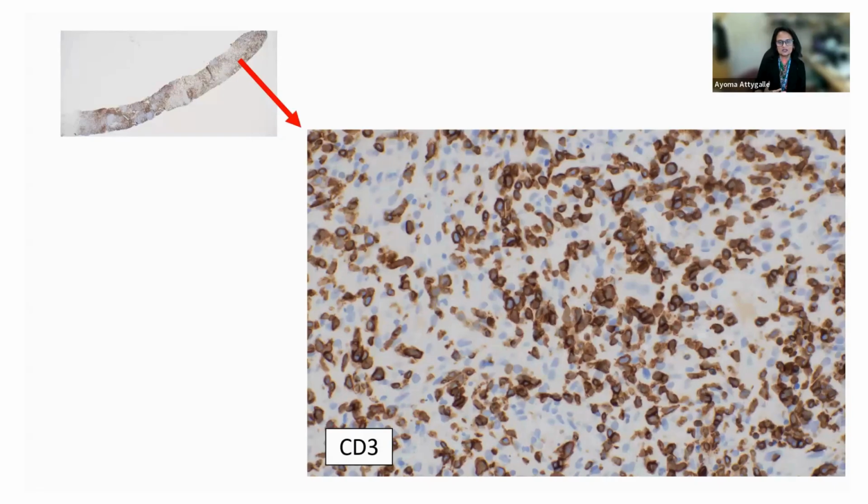Again, you're seeing a degree of atypia, a range of T cells. Some of them are small, some of them are medium sized, some of them have really very irregular nuclei. As I pointed out earlier, this is the problem in the diagnosis of T cell lymphomas: there is an overlap between the changes that are acceptable in reactive conditions and those that are neoplastic. To overdiagnose T cell lymphoma is actually as bad, or I do think in a way maybe worse than missing it. So the patients will be unnecessarily treated, and there's a lot of morbidity associated with that. So it's very important to get the diagnosis right.